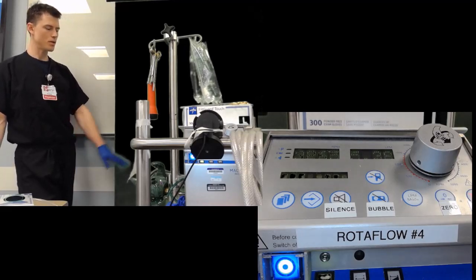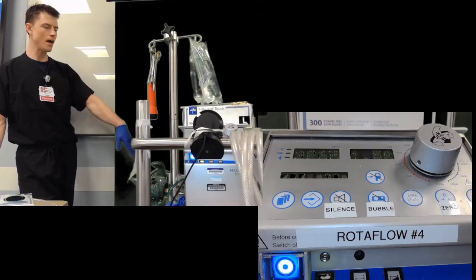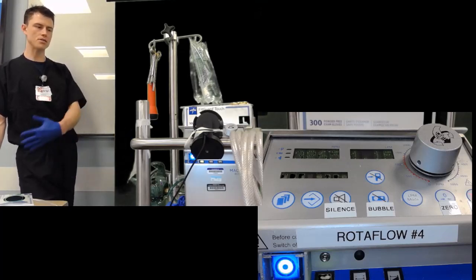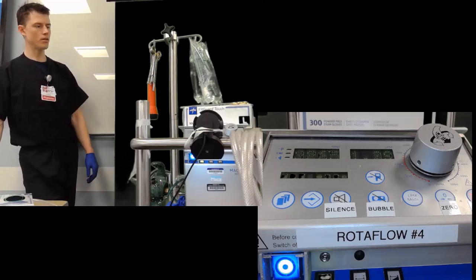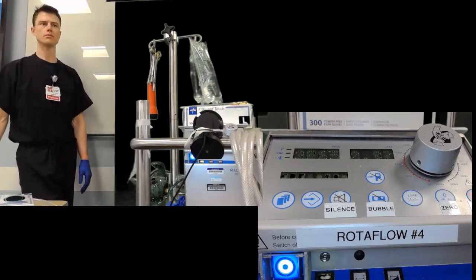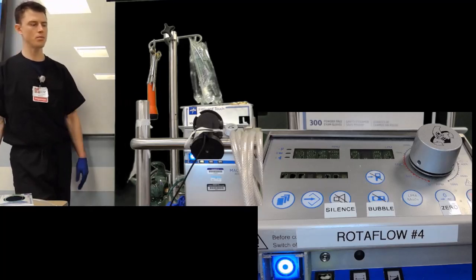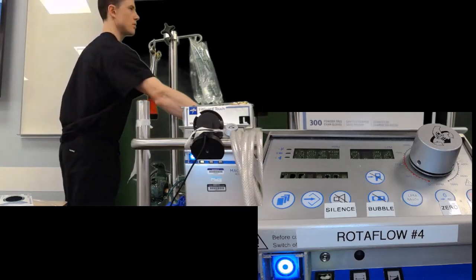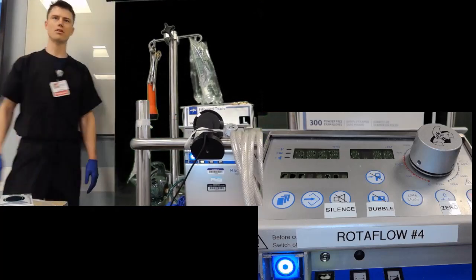Okay, cool. So we did loss of flow. Let's say you fix that, and the patient's oxygenation is still poor. We talked about it in our lecture. What would we look at? FiO2 and blood flow. Volume status. Yeah. So FiO2. Anybody want to come turn up our FiO2? I'll mess with it. Okay, we'll come up and fix our FiO2.